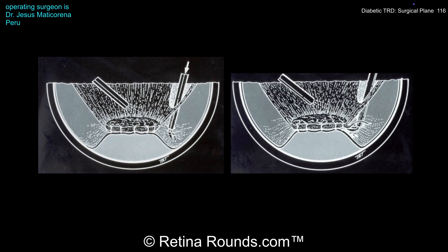For cases where the underlying retina is detached, bimanual dissection can be helpful due to the lack of underlying retinal countertraction. In this case, Dr. Maticarena was able to perform the dissection with one hand using the vitreous cutter, scissors, and forceps. He was able to avoid creating any iatrogenic retinal breaks not only due to his surgical skill but also by keeping his instruments in the correct surgical plane. Thanks to Dr. Maticarena for showing us this key surgical principle and for sharing this case.